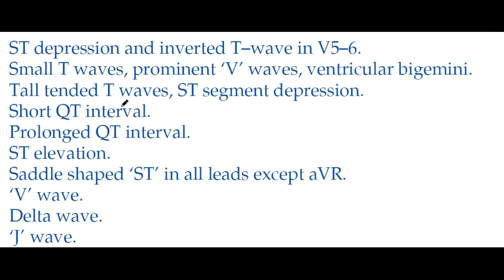Hello friends, let us now learn about the differential diagnosis for these. First, ST segment depression with inverted T wave in V5, V6 is seen in digoxin toxicity. In digoxin toxicity, we see ST segment depression with inverted T wave in V5, V6.